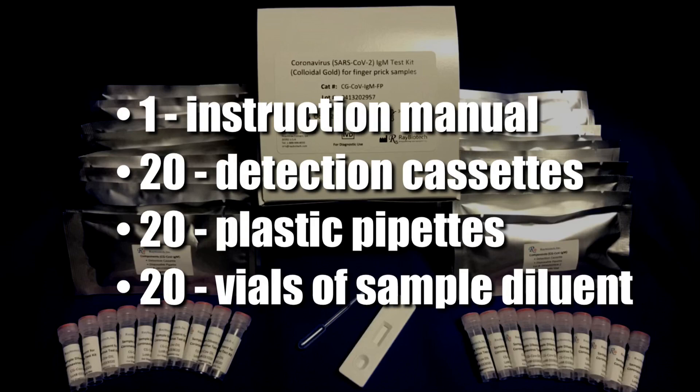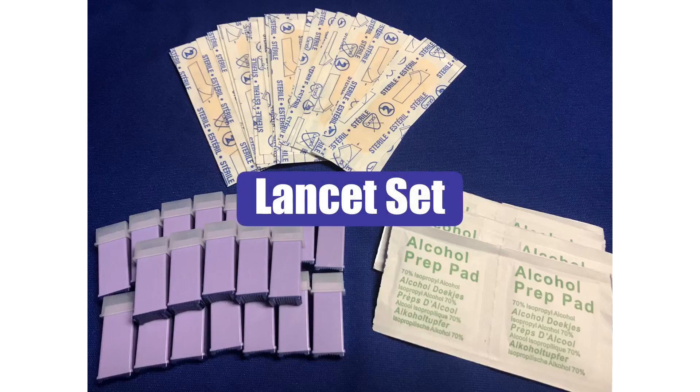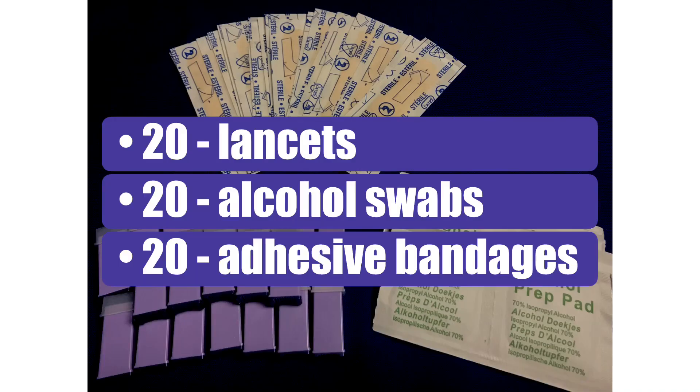Both the detection cassettes and pipettes may be inside the foil packet. The lancet set for finger prick samples can be purchased separately and includes 20 lancets, 20 alcohol swabs, and 20 adhesive bandages.